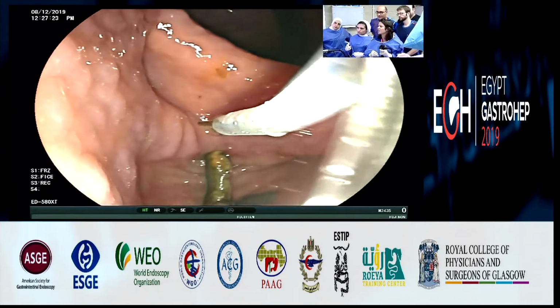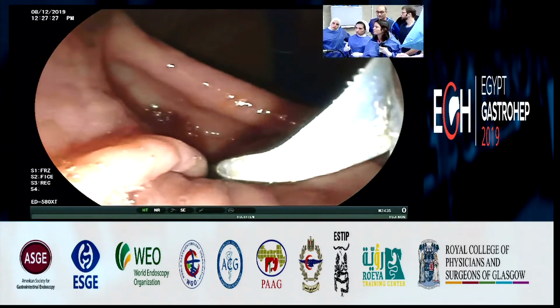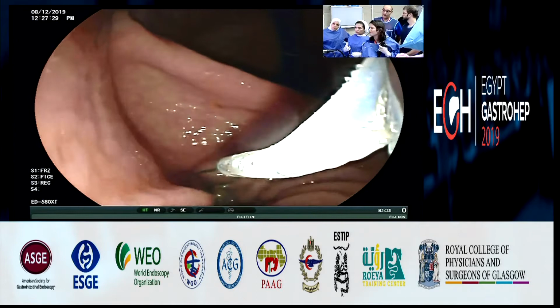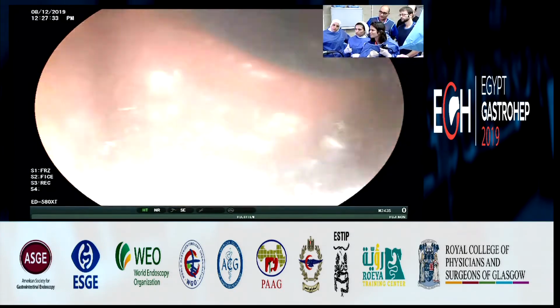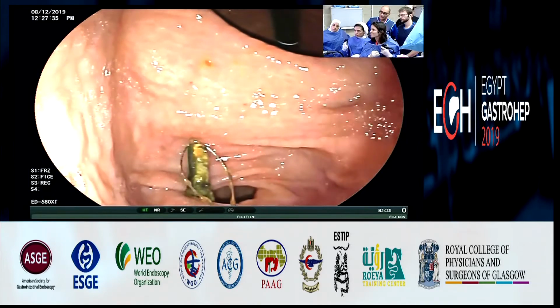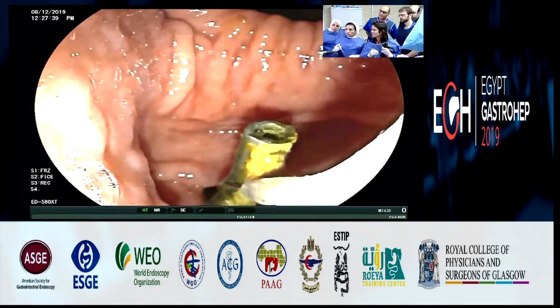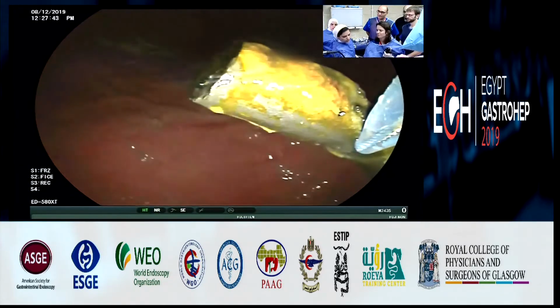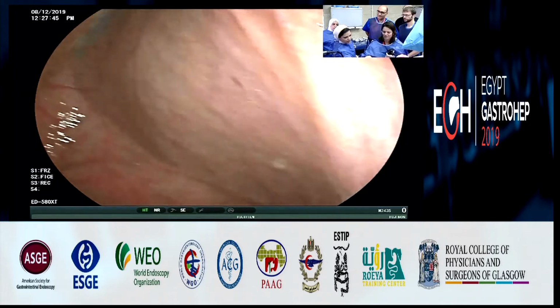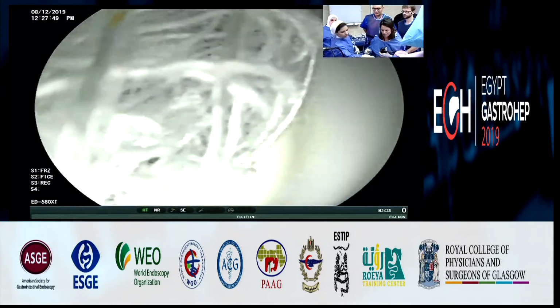Yeah. And you didn't notice any stones on cholangiogram or MRCP? Okay, you can close. The third one is the good one, huh? There we go.